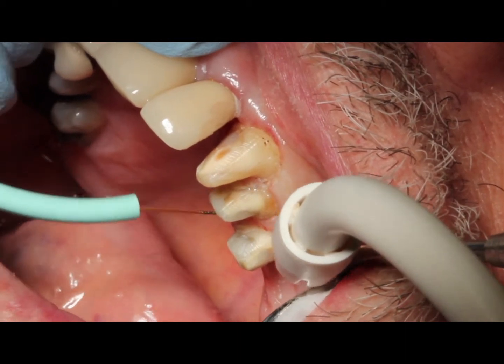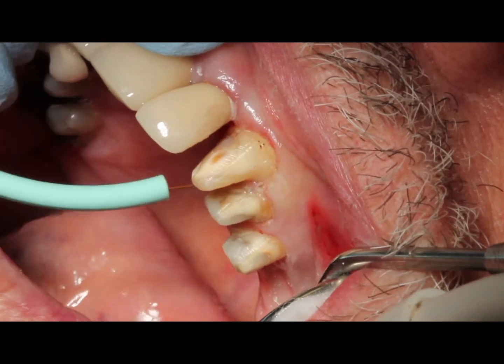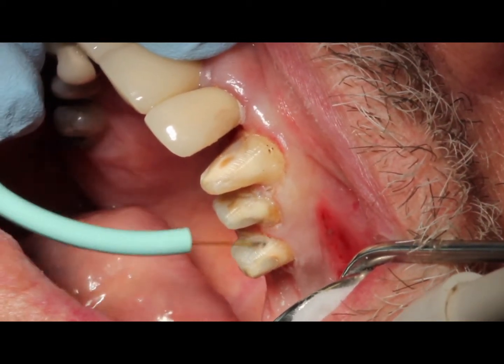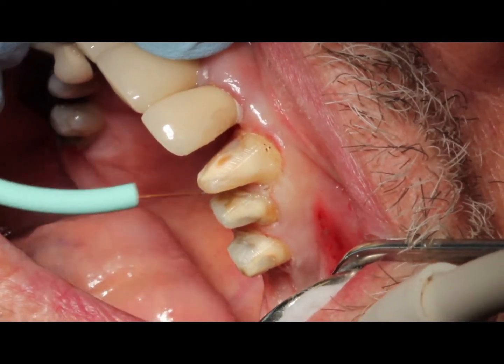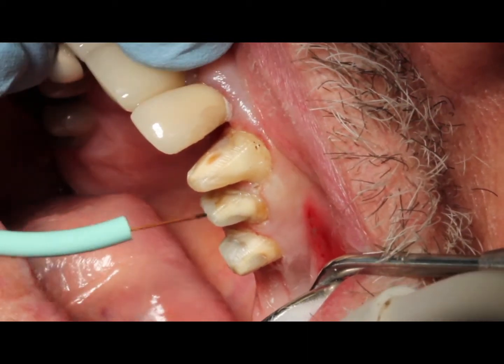In this case we're not getting a lot of bleeding. We want to place the tip — it's an initiated tip — into the sulcus, and we're just sort of stroking along the tooth, trying to clean that out and open that up just a little bit. As we do that, we do need to wipe the tip off because we will get a little buildup.